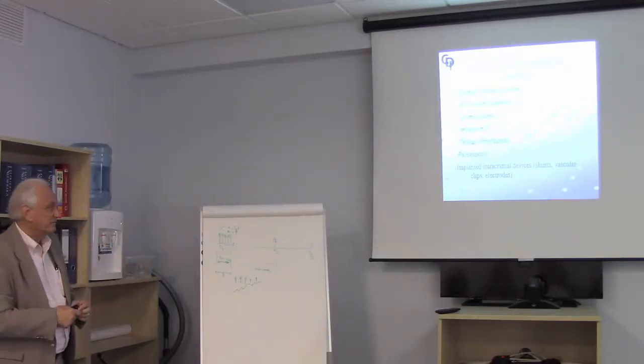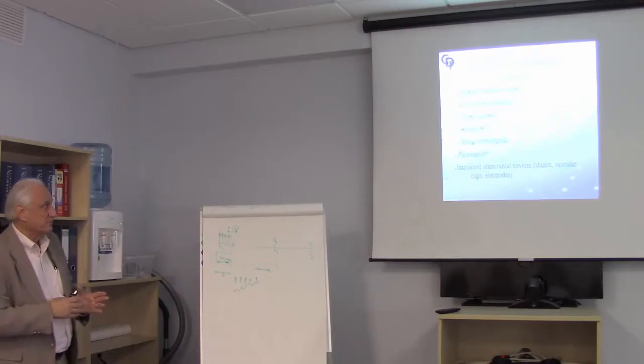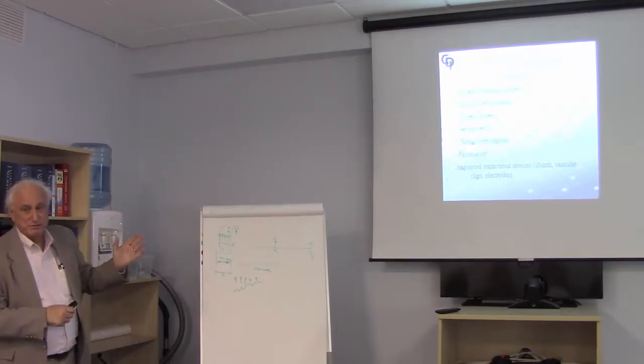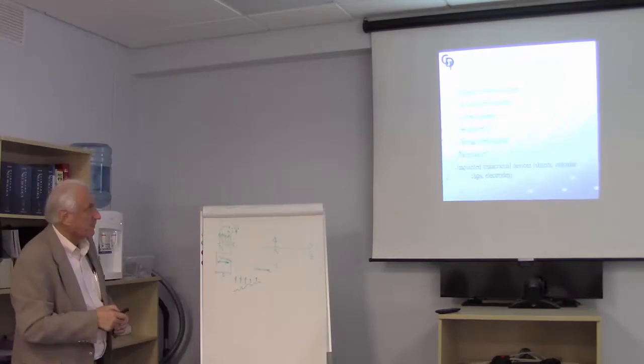That's something the surgeon's got to understand and think through, about what the risk profile is for him in that particular operation. So, again, I put these all as relative. Some people will say they're absolute. I think they're relative. I think these are things you need to discuss and be clear about.